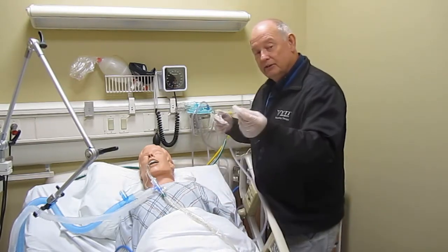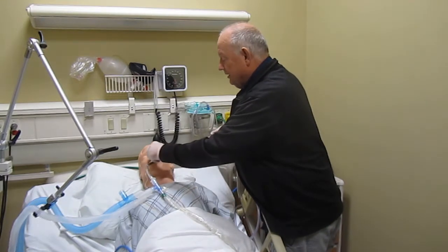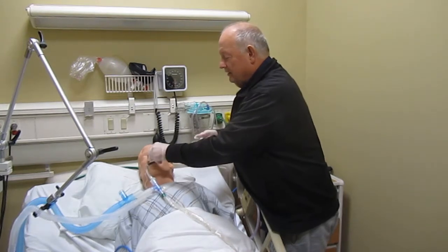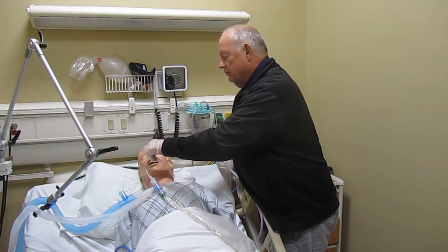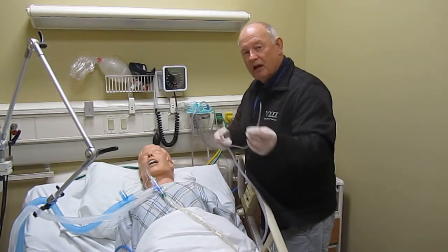Then you usually use this by going down the nares. Gonna suction ya. Gonna make it cough. Push that all the way down to the airway. Apply suction and suck out those secretions. When you exit the nare, keep control of it so it doesn't fly around the room.